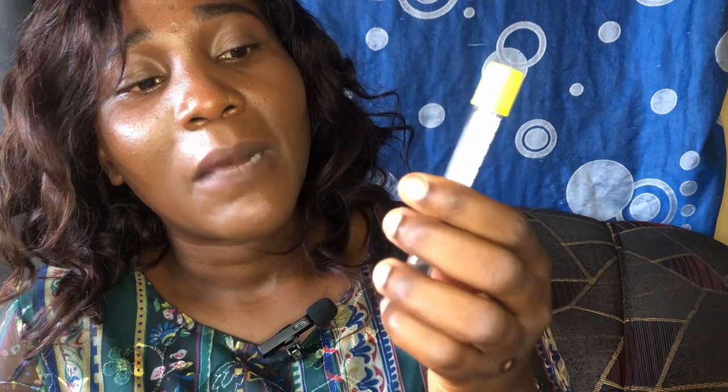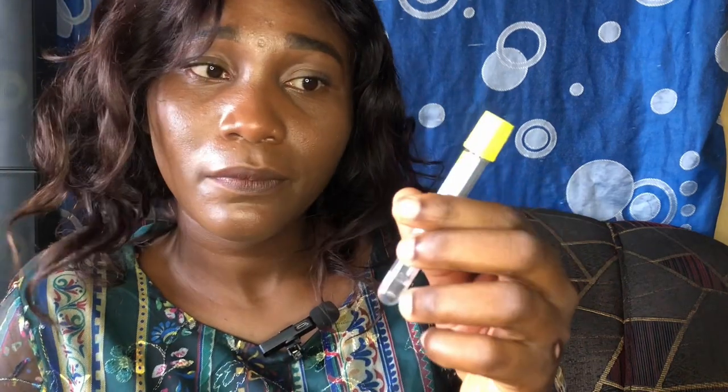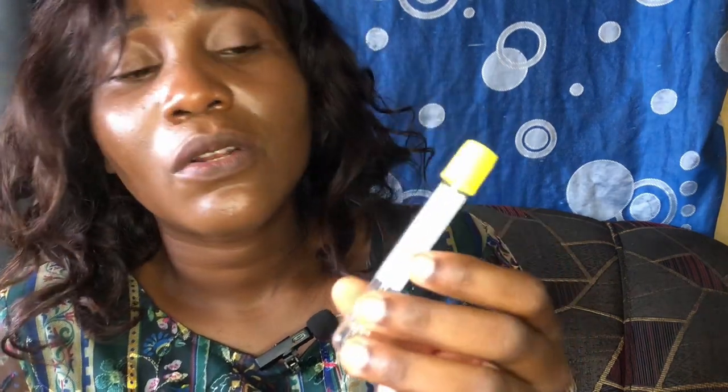It will define your serum. The reason for this gel and clot activator is that it will quickly give you what you want. This is usually used in chemistry too, but it's not as common as these three red top tubes. We separate the cells from them, so that's why there's a gel clot activator.